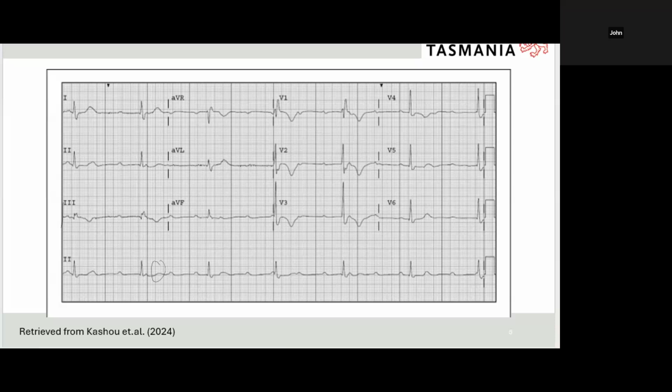Yeah, thanks. Just asking a question, because I'm sitting in front of the computer, I've always been taught to use a piece of paper where you can mark the P waves that you can see and then slide it left or right, and that helps identify if you've got P waves hidden underneath the T waves or complexes.